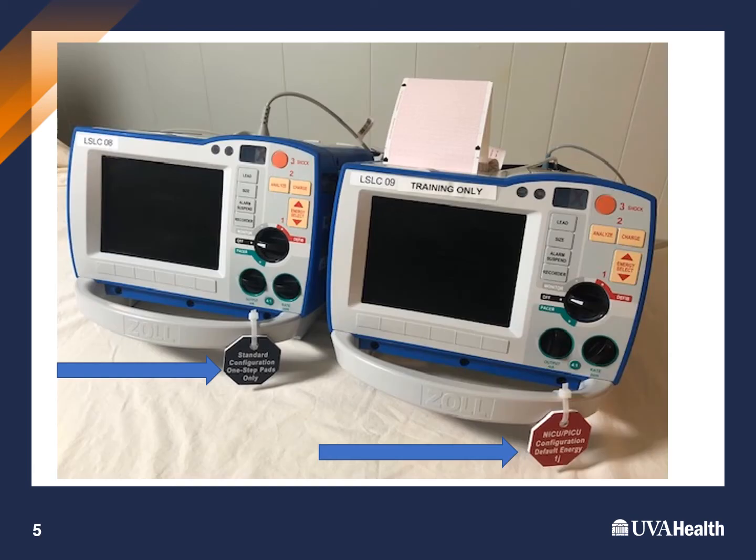Here's examples of 2 defibrillators, and you'll see the different tags that are on them. The one on the left is the standard configuration that when you turn it on, it's going to start at 120 joules unless you change it. The one on the right, the red tag says NICU-PICU. It will default to 1 joule, and it will need to be increased for the appropriate level for your patient.